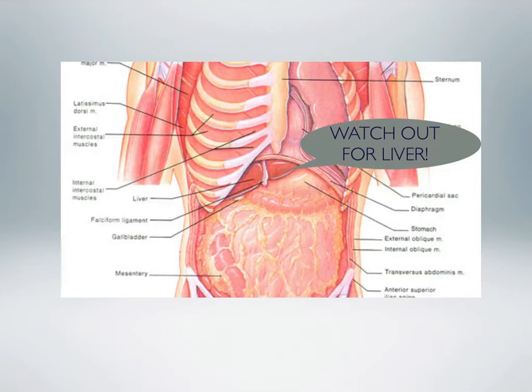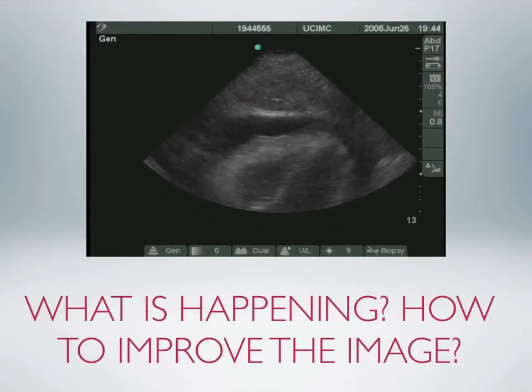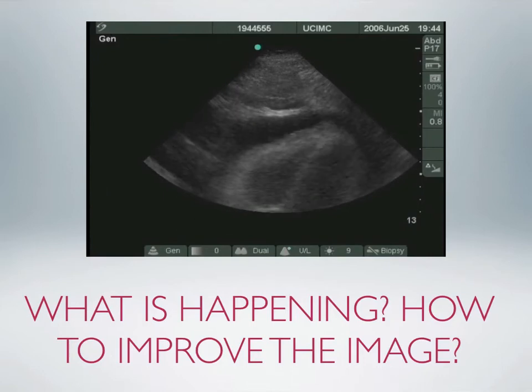But the bleeding issue is the big one in the U.S. If I had somebody in DIC, or somebody who was on Coumadin and you were afraid they bled into their heart, someone who has a bleeding diathesis, I would probably go parasternal. But the information on that, in my opinion, is purely anecdotal. I don't know of any major reports showing complications by going through the liver. So it's somewhat theoretical.